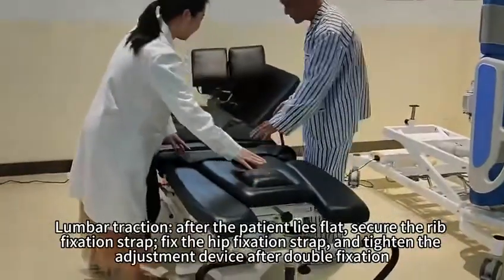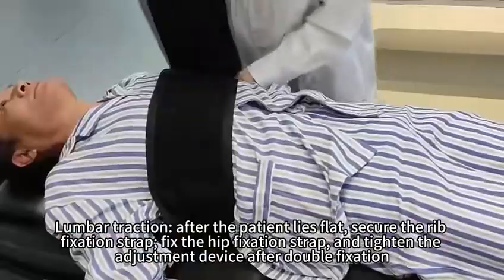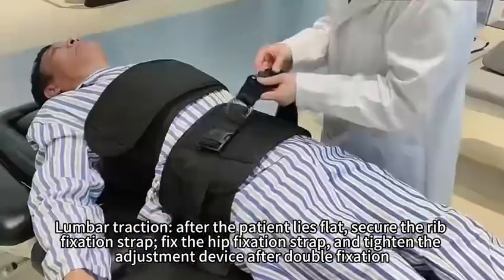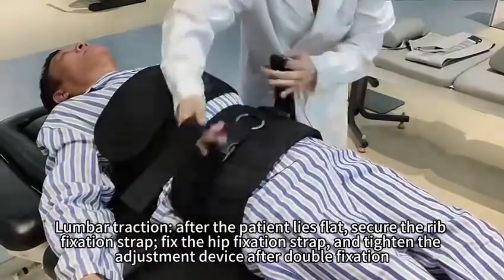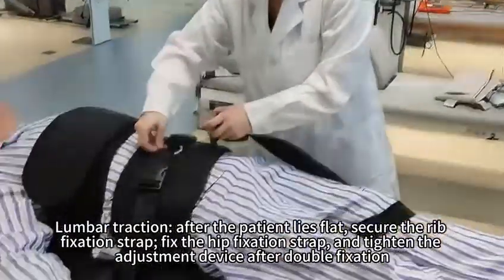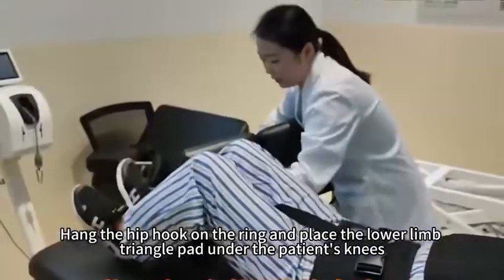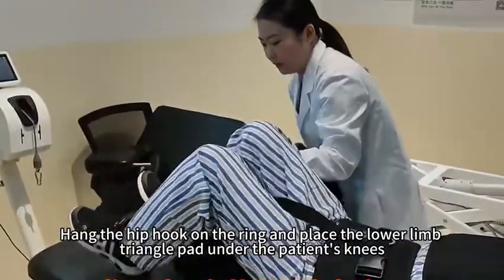Lumbar traction. After the patient lies flat, secure the rib fixation strap. Fix the hip fixation strap and tighten the adjustment device after double fixation. Hang the hip hook on the ring and place the lower limb triangle pad under the patient's knees.